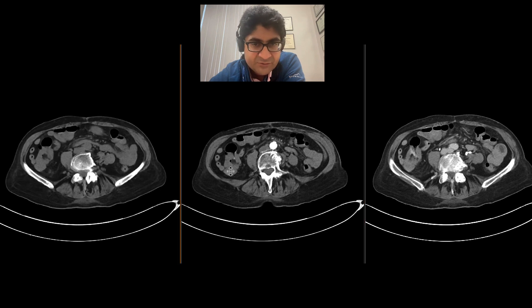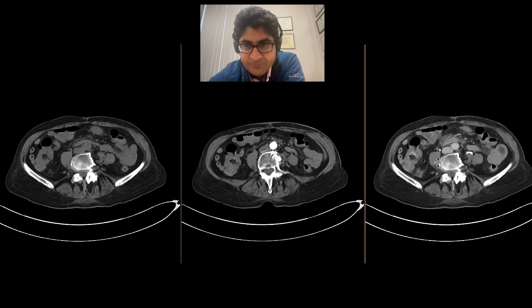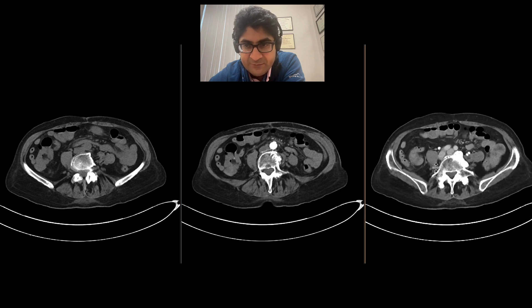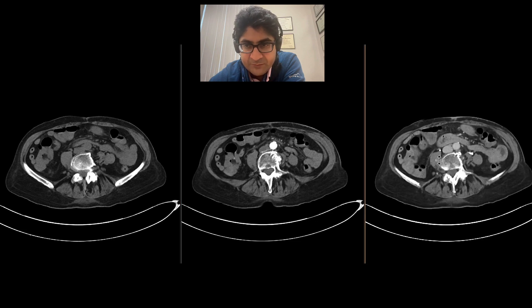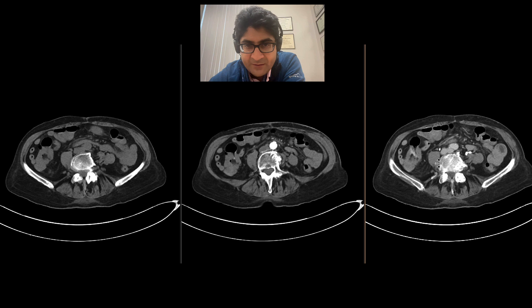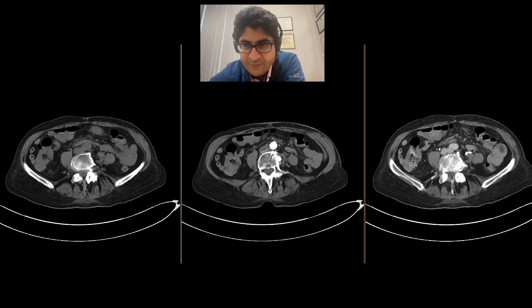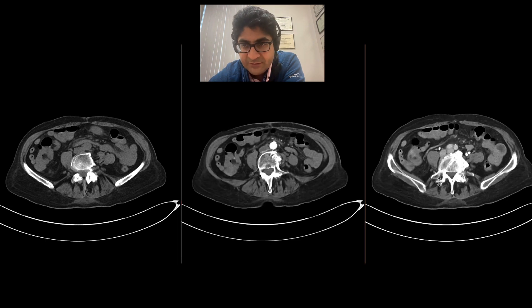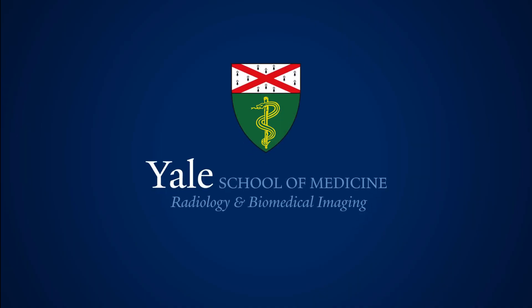These findings are compatible with an active bleed right in the cecum, in the vicinity of the ileocecal valve — a finding that was present on the arterial phase, somewhat subtle, but it was there, and much more evident on the delayed phase images. Thank you.